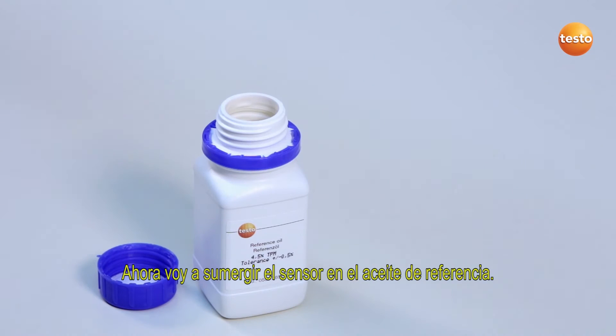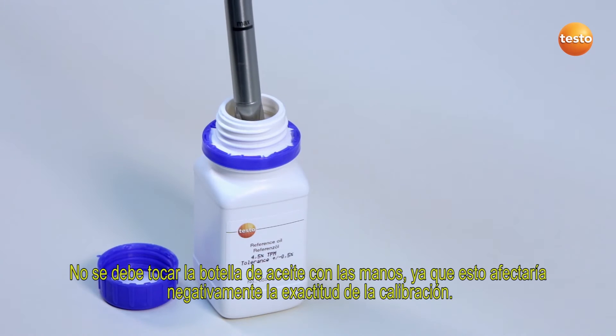I now immerse the sensor into the reference oil. You should not touch the oil bottle with your hands, as this would negatively influence the accuracy of the calibration.